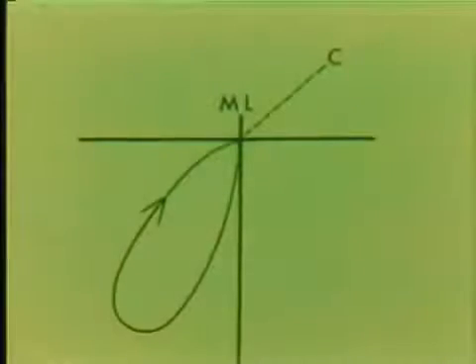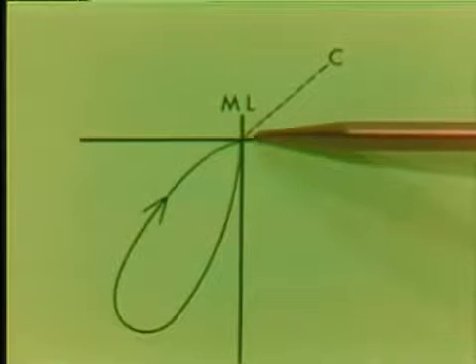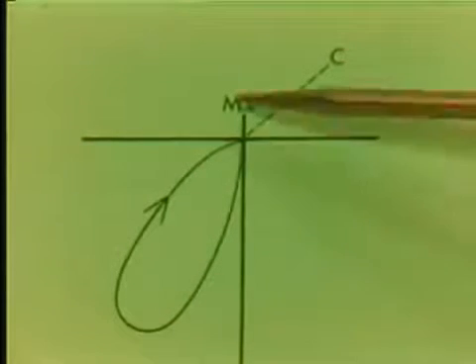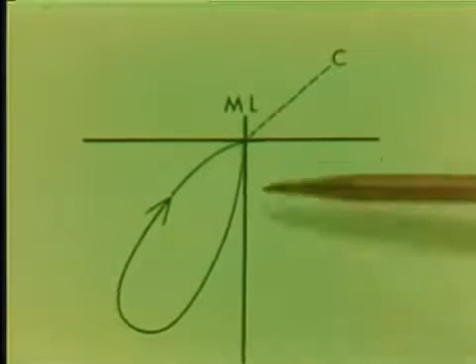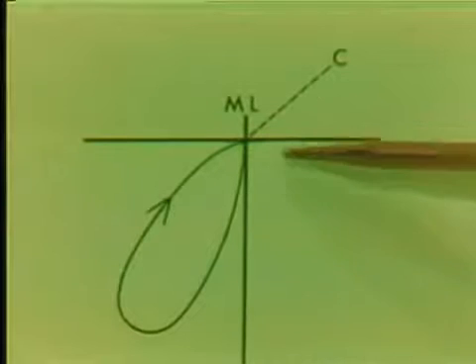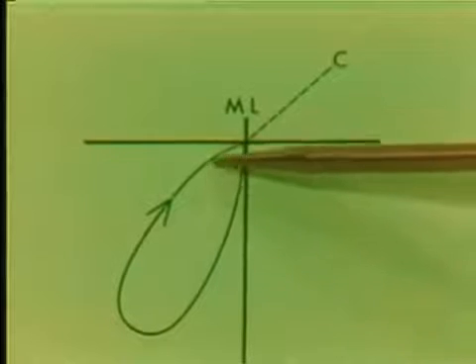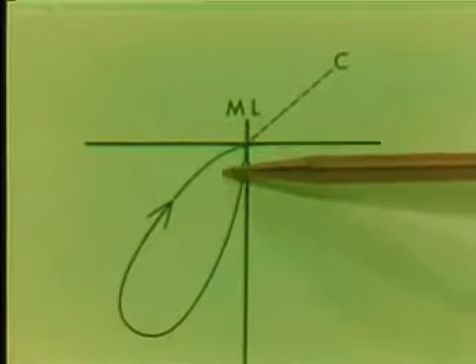In the next diagram, then, we would show what might be the unilateral pattern of chewing, where a patient follows this pattern, with the solid line being the midline, and the C meaning center. As a patient chews, when they first begin to chew, they have more gross movements, and then in the final stages of chewing, they would chew just around the center line, as was demonstrated in the previous diagram.